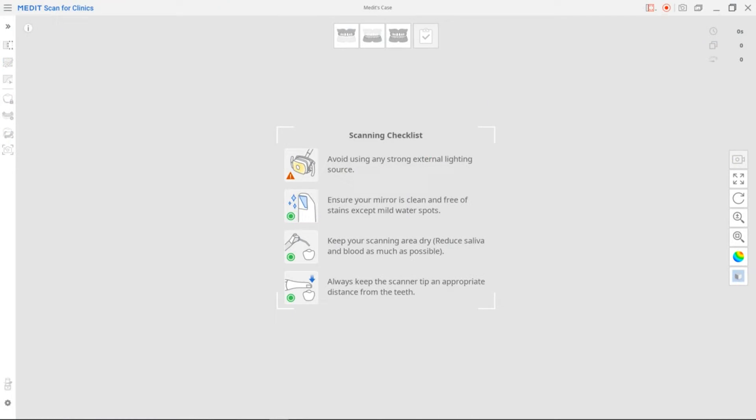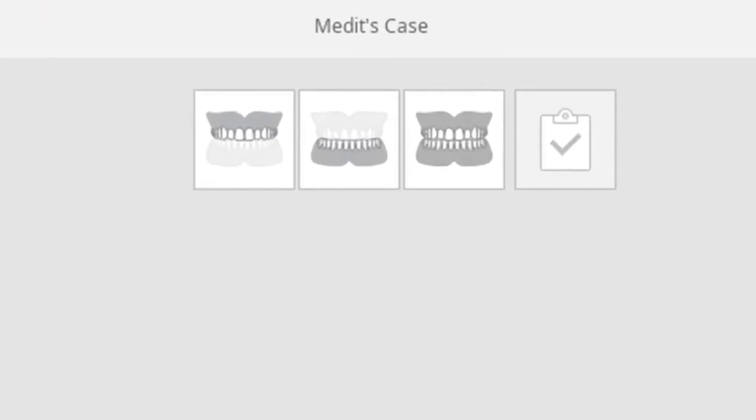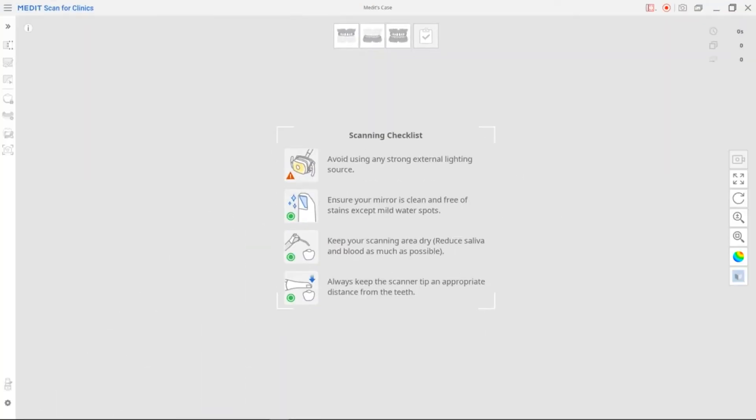Starting from the left, the scan stages are as follows: Maxilla, mandible, and occlusion scan stages. The configuration of the scan stages is going to be different depending on the form information.